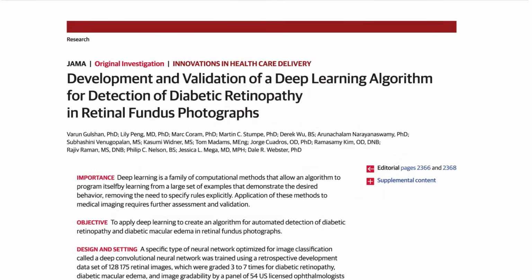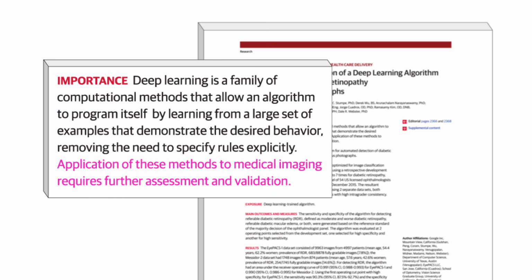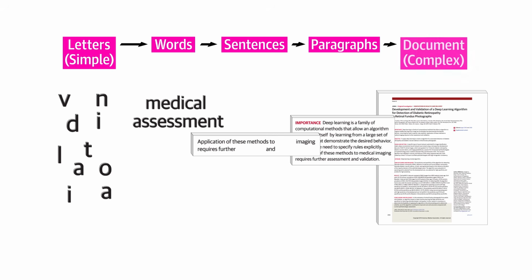Now that we've explained what a filter is and introduced the concept of convolution, let's use an analogy of written language to understand the relationship between the filters and the hierarchical structure of the layers in a CNN. We will simplify the explanation by using an analogy. The analogy is a written document. In order to communicate through writing, we organize it as a series of paragraphs, which are composed of sentences. Those sentences are composed of words and the words of letters. So reading a document requires assessing the relationship of letters to one another in increasing layers of complexity, which is a kind of deep hierarchy, like the hierarchy in image analysis.